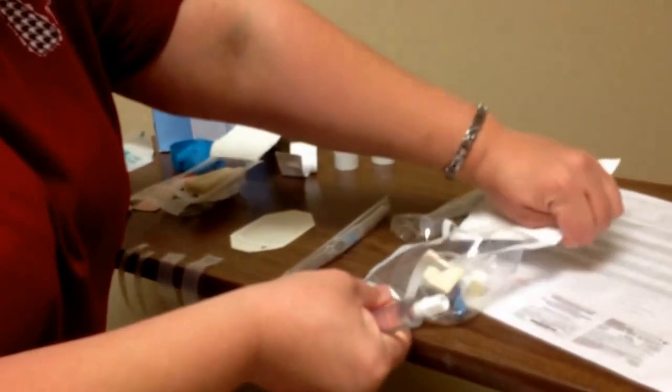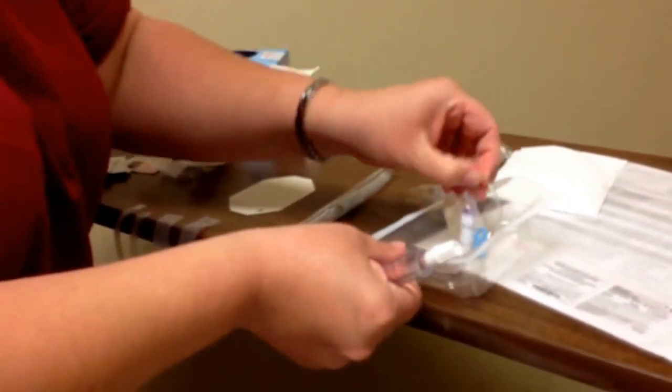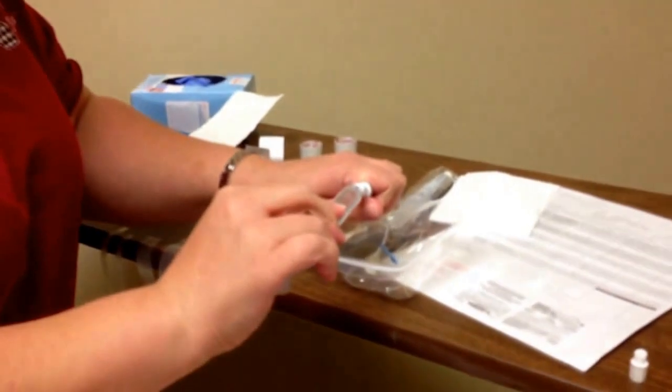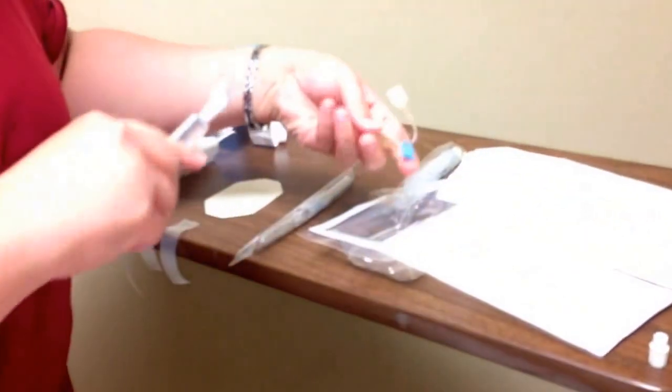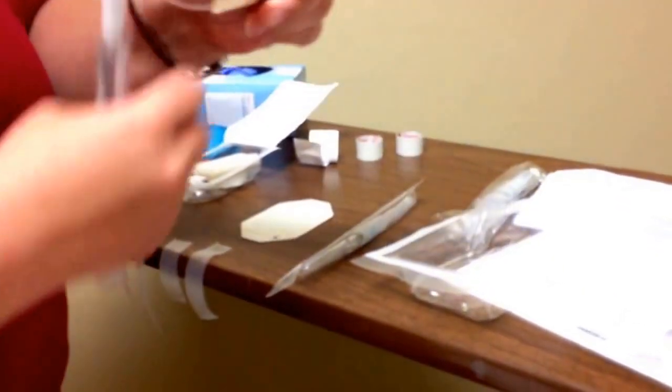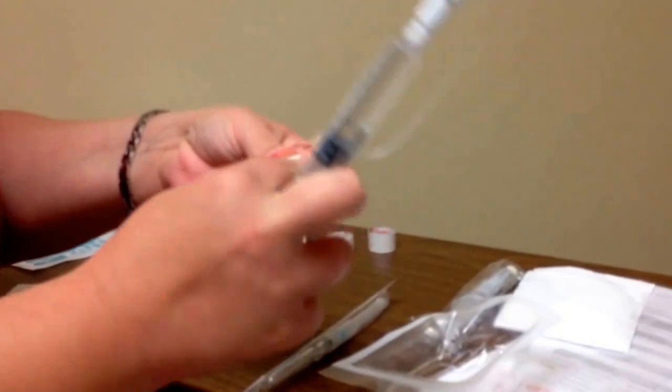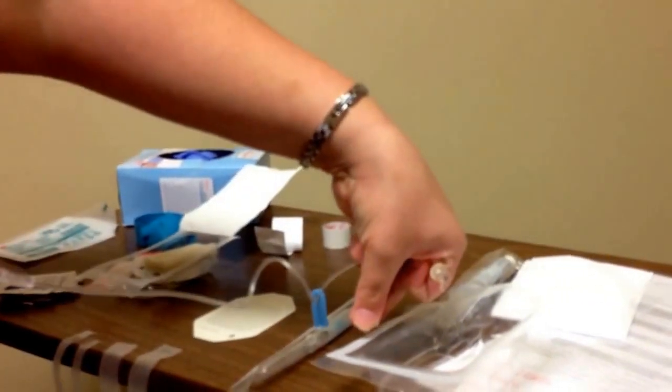I'm going to open my extension set. Since I've just opened it, I don't need to swab it with alcohol. I'll keep this cap sterile. If there's any air in my syringe, I need to get it out. I'll access the extension set, take the cap off — keeping it sterile — and flush it with saline just to get it primed. Then I'll set it back.